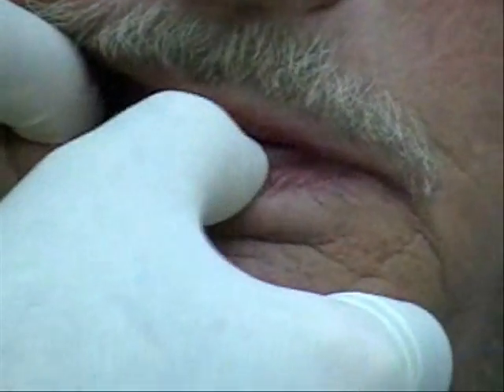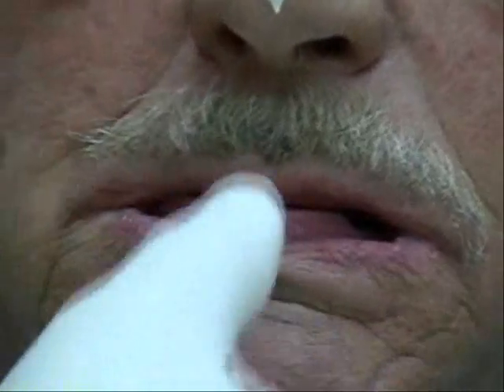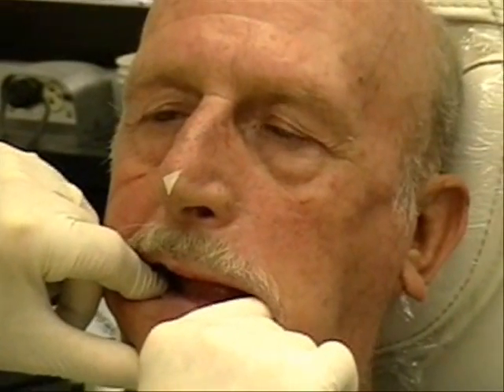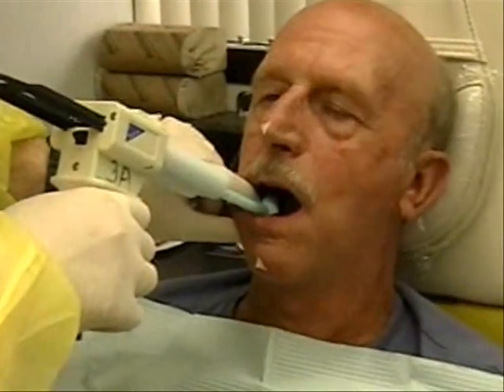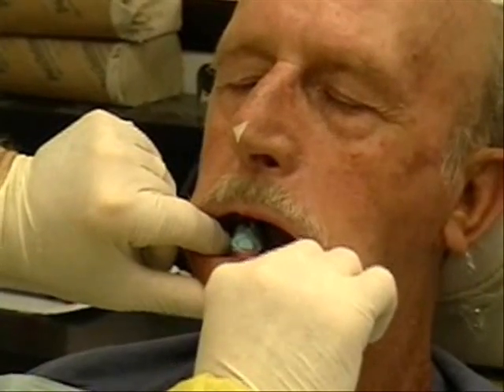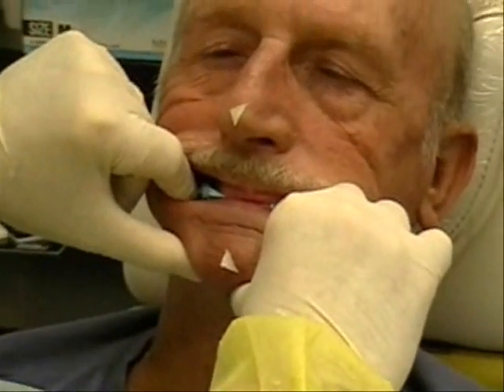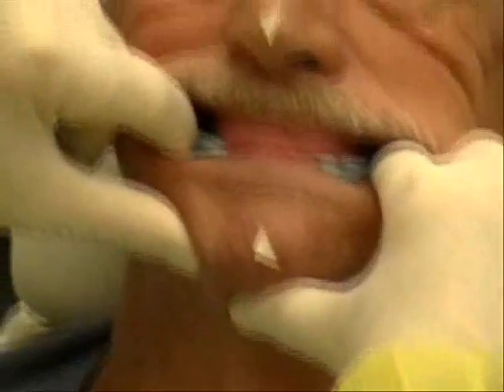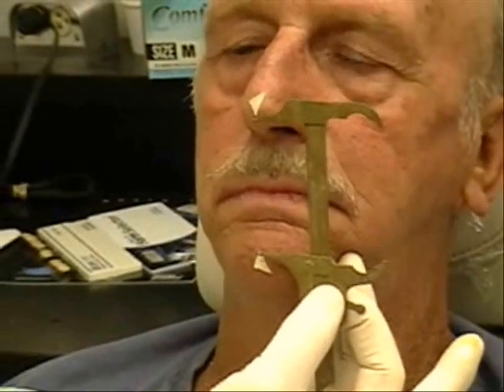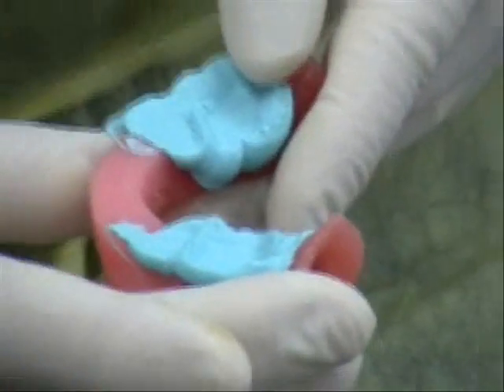Go ahead and close. Open for me and relax your jaw, then close. You're doing wonderful — can't ask for a better patient. Just relax and go ahead and close. Don't move — stay together. It takes about 30 seconds for it to stop. I'm going to re-verify, and it's right back where we need to be. Great. I'll have you show how to fit it, just to make sure all the parts go together.